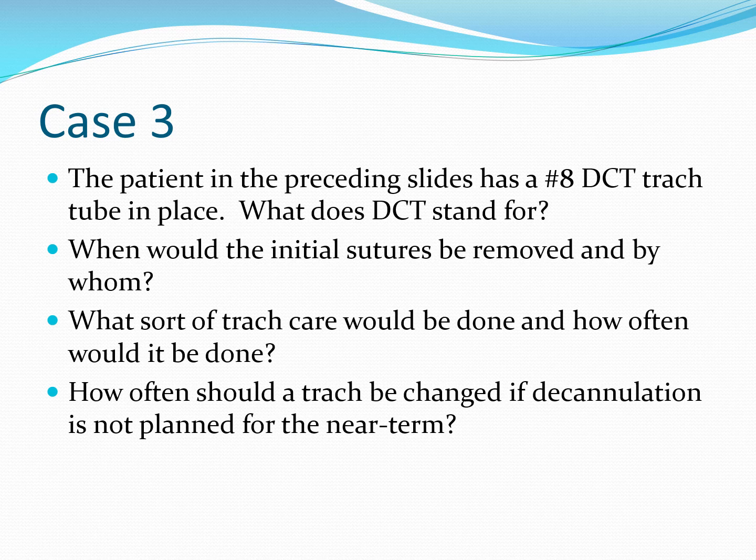And they're flange sutures. It can be done by us, it can be done by nursing. Sometimes the physician will want to actually do it themselves, which is fine. There's a suture removal kit, and just take great care, cleaning the site where the stitches have been removed and making sure that all the suture material has been removed. That could be a potential cause for infection, so it's of critical importance to do that.